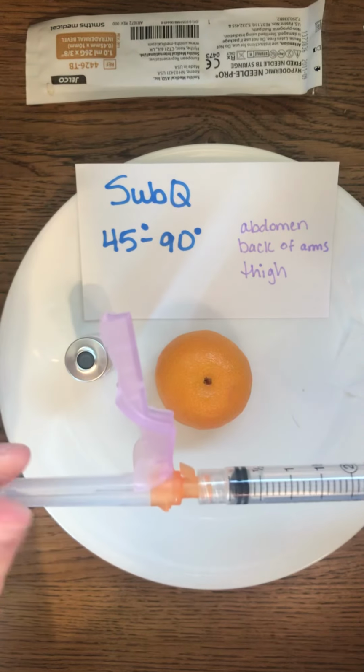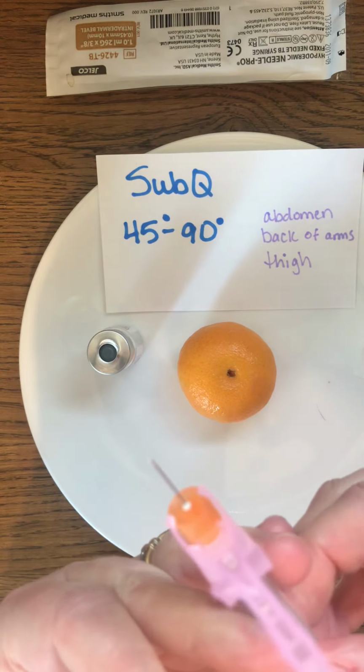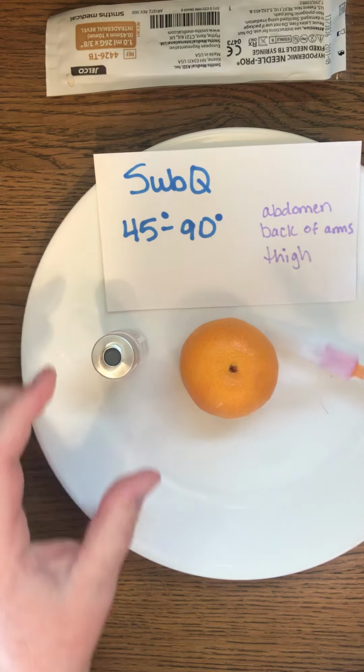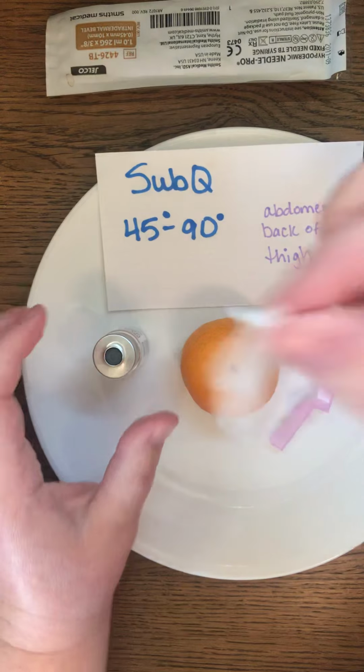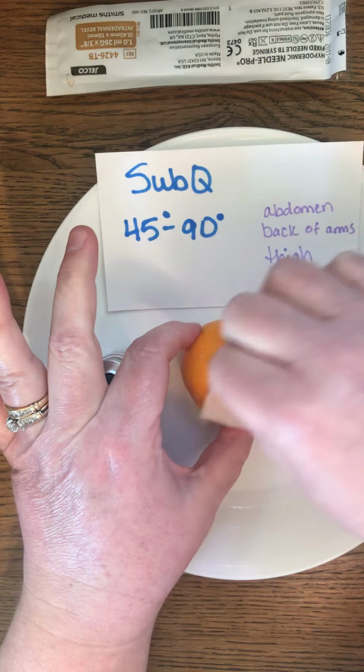Again, we have our safety thing here. Our needle is the same. You can see there is a bevel there. And it's hard to see, but it is there. And we can get going here. So, same thing as before. Of course, this is brand new, right? We're going to clean this off. We're going to clean our patient's skin.